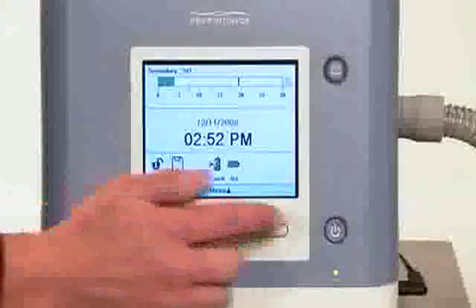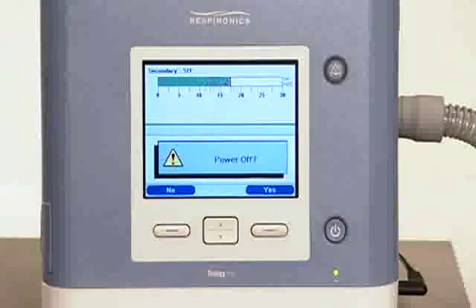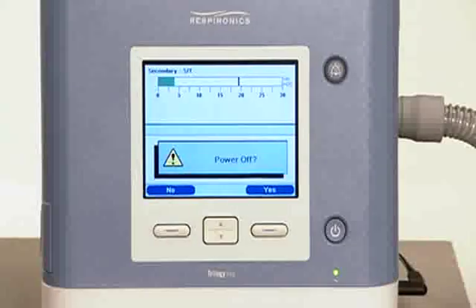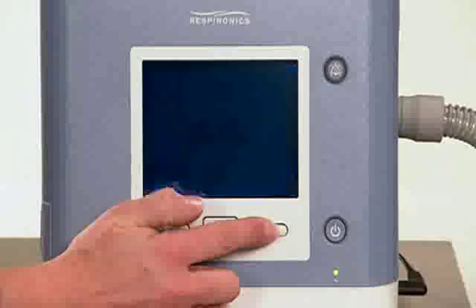To end therapy, press the start-stop button on the front of the device. You will hear a short tone. The display screen will pose a question: power off? Press the right button to answer yes. Both the back lights and the display screen will turn off.